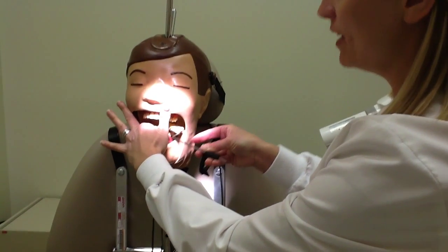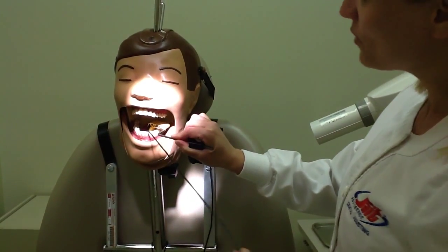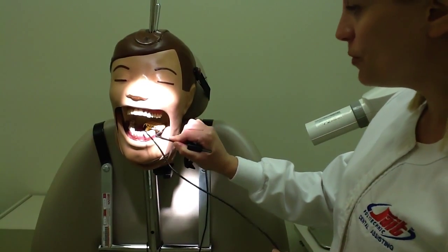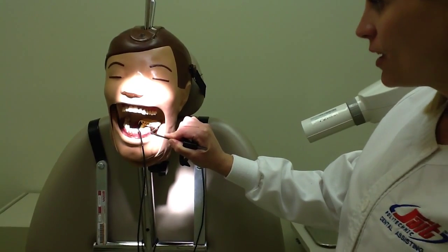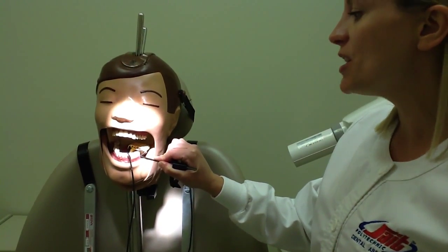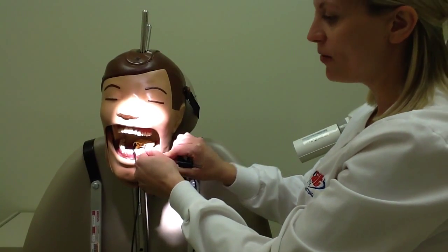So that's the P. The P is for position. Again, we're going to center it on the receptor. We're going to seat it, our two-point contact. We're going to make sure our sensor is parallel to the long axis of the tooth. And then the R stands for relax. You're going to have the patient relax and slowly close down.